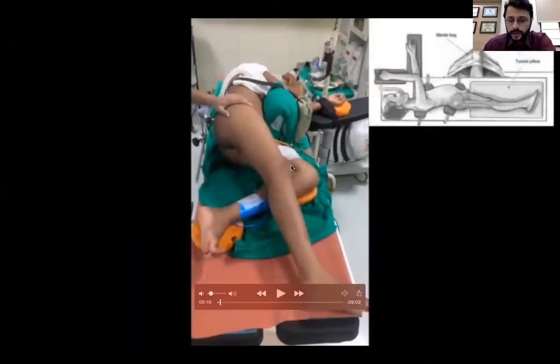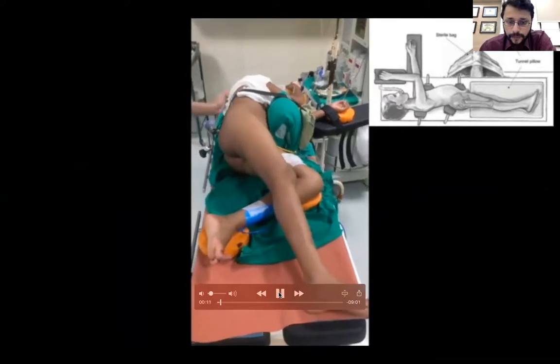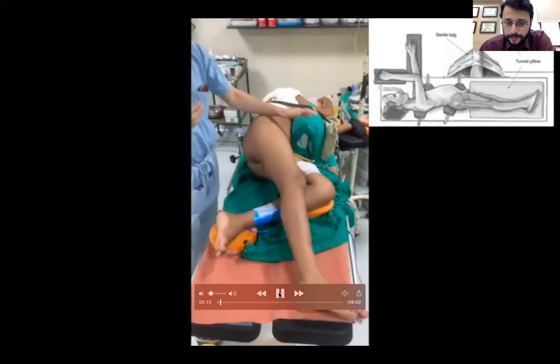Now, patient position is very important. This has to be dead lateral. The other side has to be very, very well padded, because the entire weight of this limb is going to be on the other side. So always remember to have very good padding of the other side. This anterior bump should be well above the anterior superior iliac spine of the ipsilateral side, so that you should be able to do at least 90 degrees of flexion of this side. Right. So it has to be dead lateral.